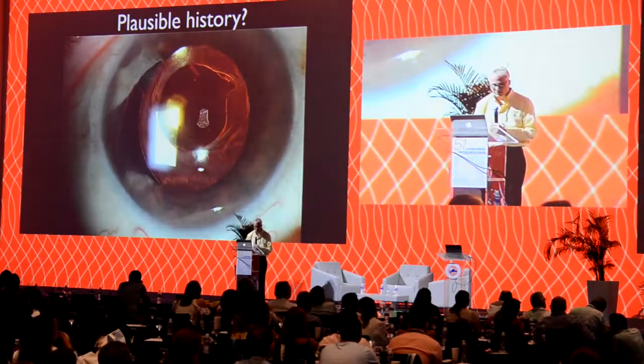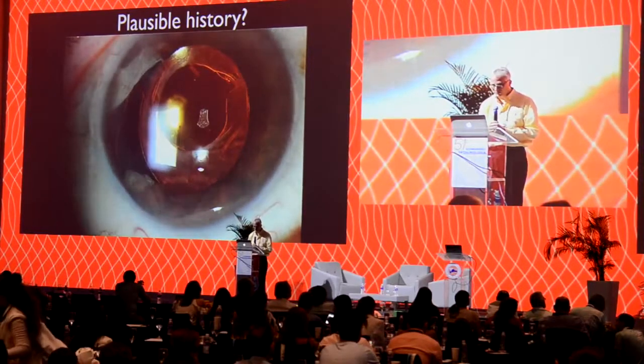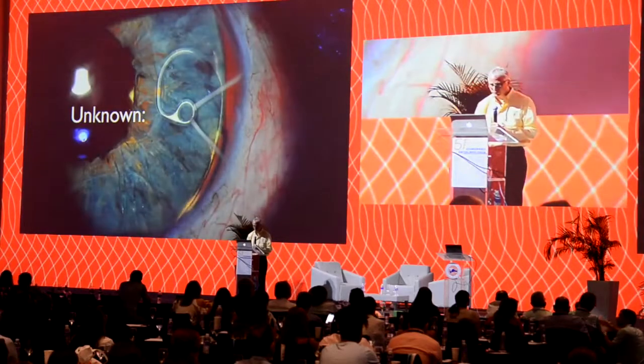So, spend enough time talking about that. Who thinks they know what happened here? Anybody want to throw out a guess? This is a phaco burn. This was a phaco burn that melted the iris away. Ouch. Got an artificial iris, did well.